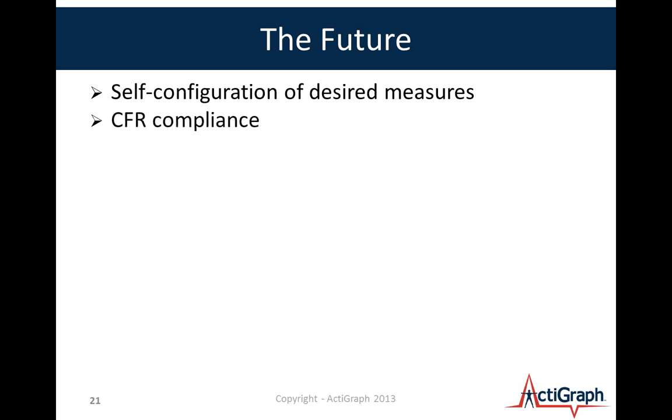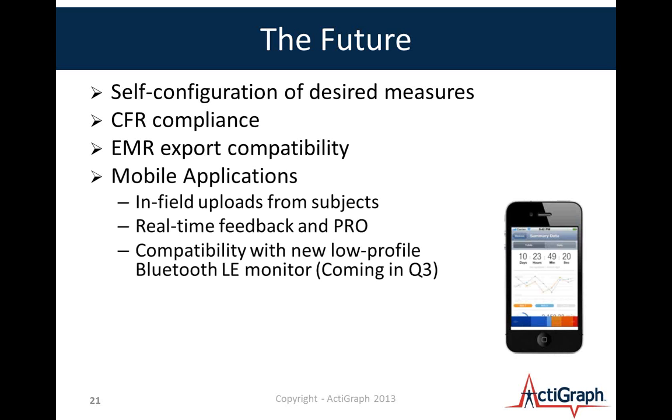CFR compliance, I briefly spoke about that. We're working with some of our clients now to make sure we meet their regulatory needs, because we at ActiGraph would be audited by the company themselves, who are preparing to collect the data, and we have our own FDA guidelines that we have to meet, but we also need to meet those higher regulation requirements for secure data storage and transfer. EMR export compatibility, we'd like to offer the option to export data into specific EMR formats.